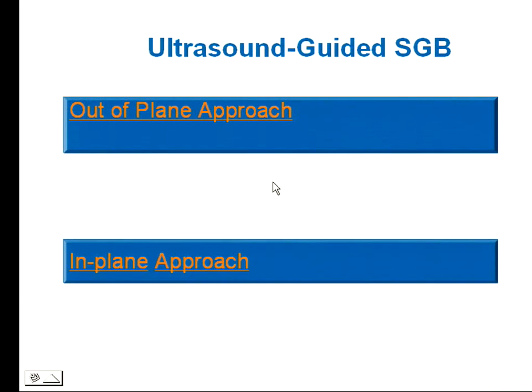Actually, the identification of the vessels in the neck was the thesis for my PhD. So how do we do it? We'll finish in 1 minute. How do we do it? Out of plane and in plane approach.